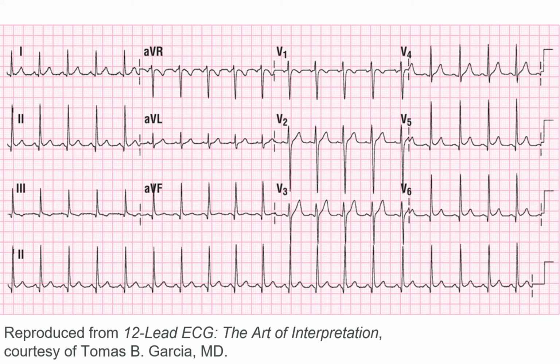Okay. 2. Nope. You say no. We got some elevation there. This is a good example of something I kind of call cupping, where it kind of U's. There's not a good J point, and that U'ing of the J point is kind of elevated up the baseline. We're going to get to that in a second. Let's look at 3. Does 3 look okay? I think we're okay.